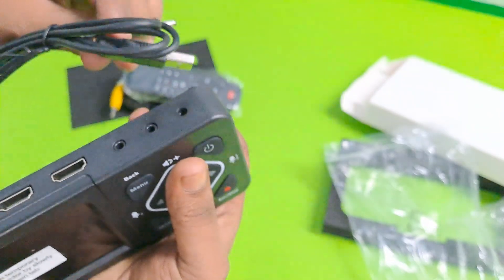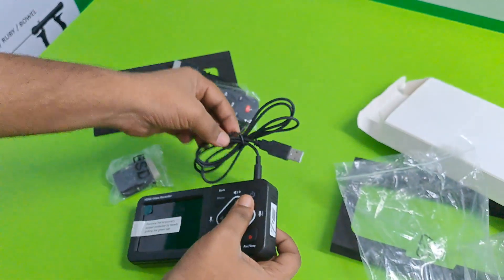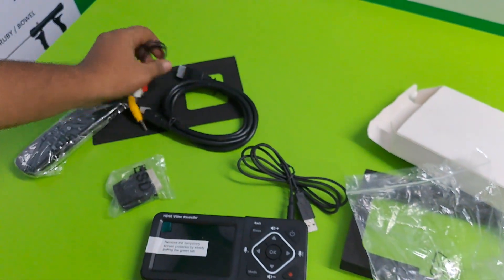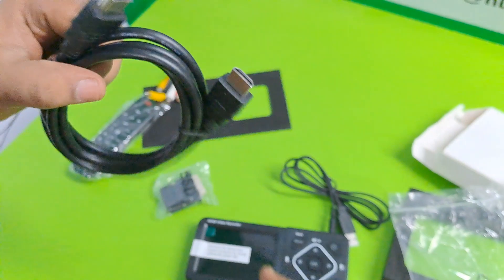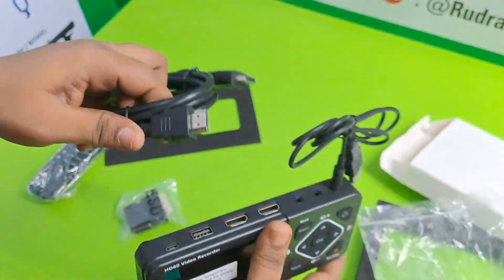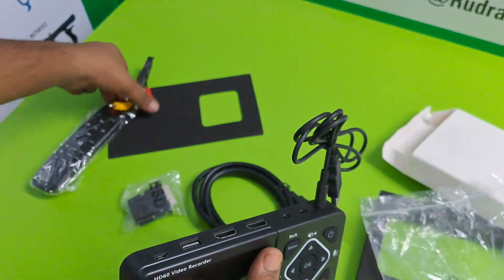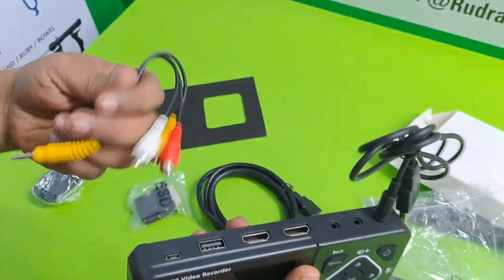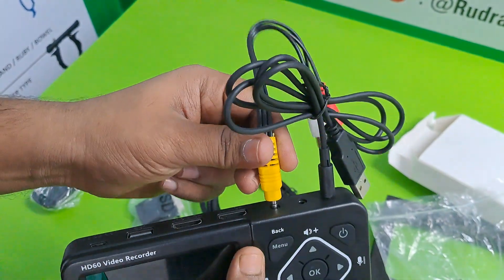This is the power point — you put here. HDMI cable, you can add here. This is audio, video, input, output — you can easily put here.